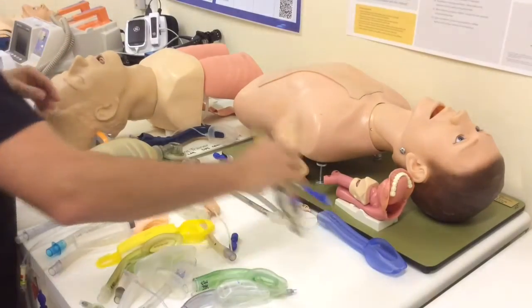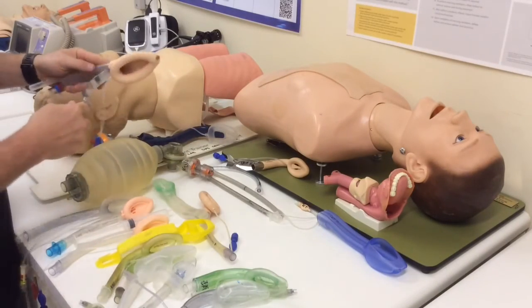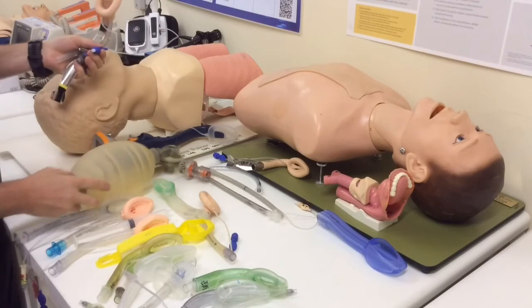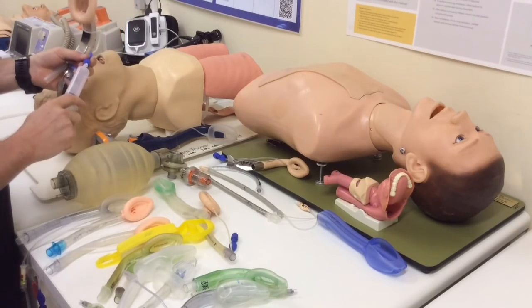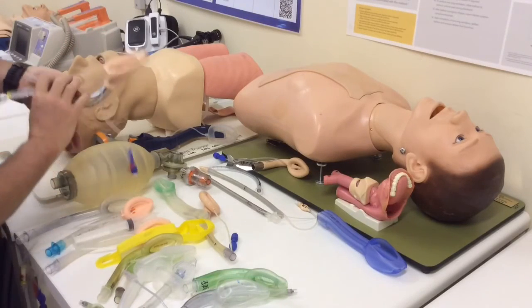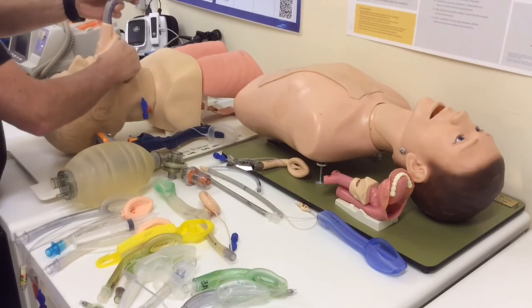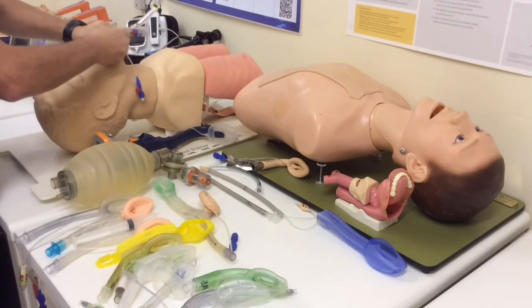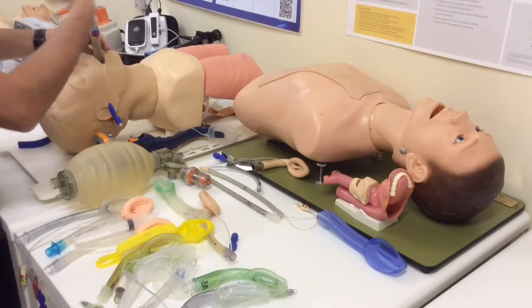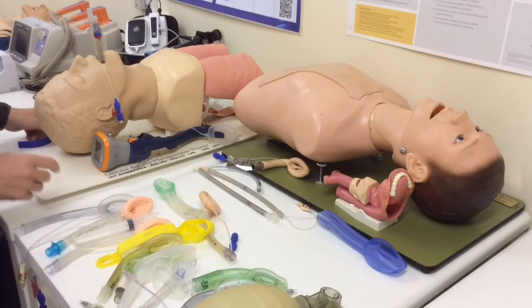Some devices do come with an adjunct to insert the device, either some kind of internal rod stiffener, or for instance this ProSeal has got an introducer that comes with it, and again you'll see that it gives the device that pre-curved shape. This is a size 5 ProSeal, which might be a little bit too big for the American man here, but let's have a look. Again, imagining I'm touching the stem against the patient's chest, I'm lifting the jaw slightly, and then advancing this device until it's seated fully, out with my introducer, following the curvature, inflate the cuff, and off we go. So that's insertion of some of these devices.